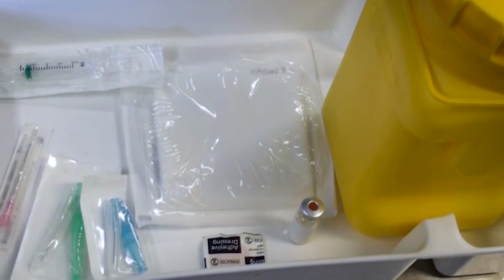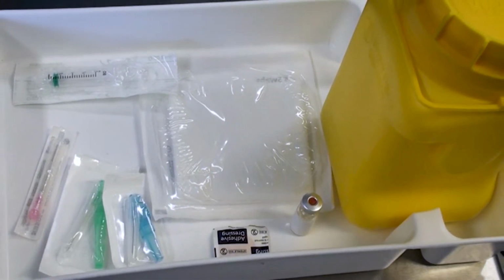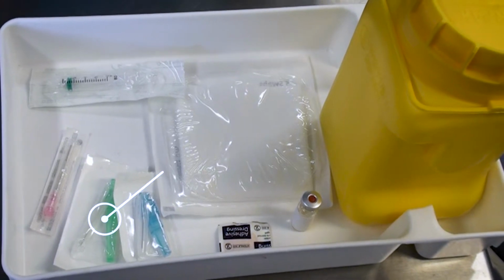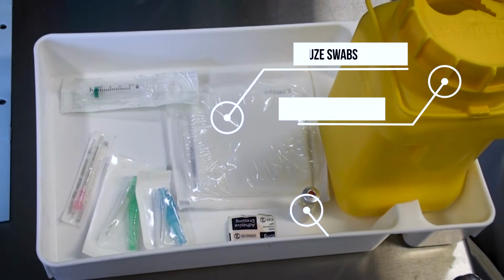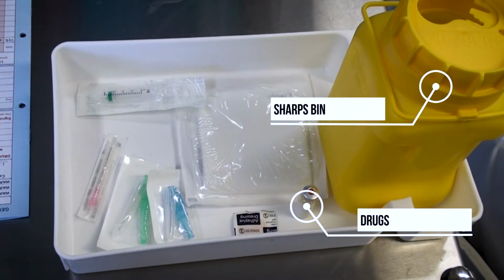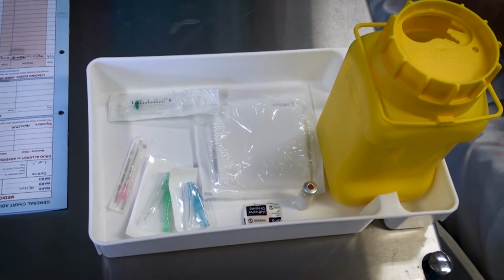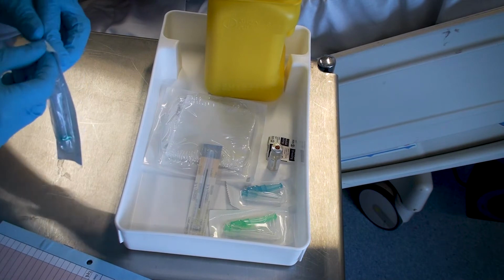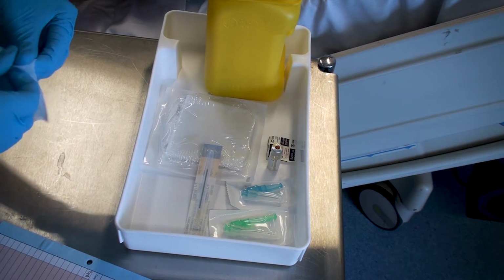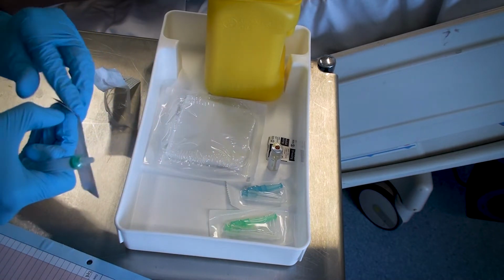You must assemble your equipment. If a pre-filled syringe is being used, then that may be appropriate. If not, we need an appropriate sized needle, syringe, gauze swabs, sharps bin, and the drug being administered. For IM injection, we can use either a 21 gauge, which is a green needle, or a 23 gauge, which is a blue needle. The size of needle would be dependent on the patient's muscle bulk, position, size, and age, as to how big they are, as to what size you will need.